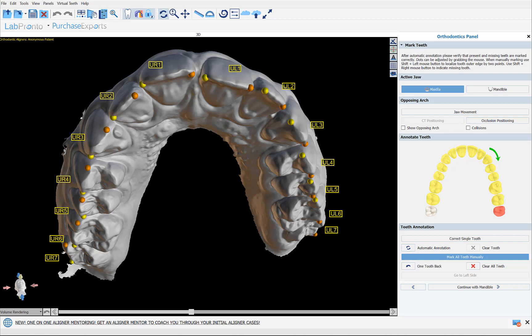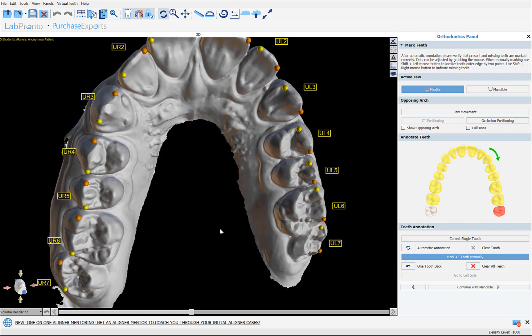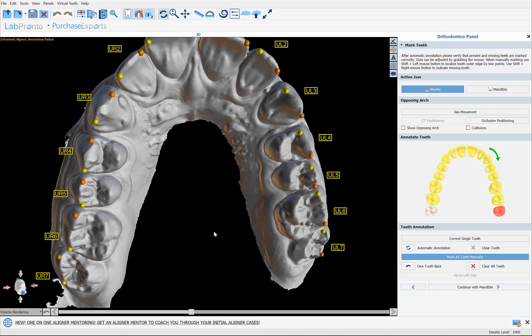Hello everyone, this is Michael from Blue Sky Bio. In today's training tutorial we're going to discuss some new orthodontics aligner features and functionalities in our latest release of Blue Sky Plan, including what we see now on the screen: completely automatic annotation where the software is automatically marking two dots on each tooth and identifying which tooth is which.